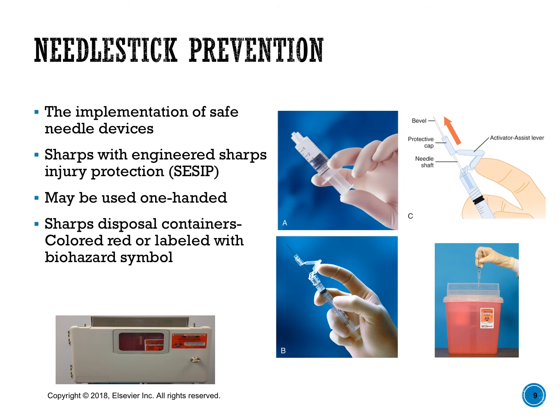So we want to make sure that, because you will have to use a syringe and a needle or a blunt tip type needle to remove your medication from the vial, you need to be mindful of how to actually use the syringe. Another thing I didn't talk about was looking at the numbers to make sure you're comfortable with the calibrations on the syringes as well.